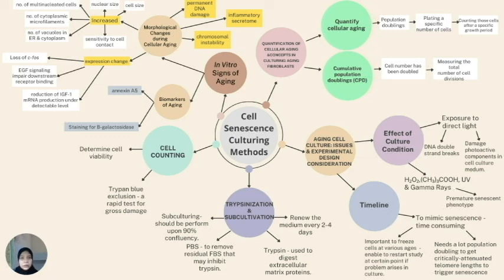It is better to study one serially cultured sample of different ages rather than using different cultured samples and examining them at different time periods. This enables the researchers to restart the study at a certain point if any problem arises in the culture, rather than re-examining the culture sample at different periods, which can take a long time and waste energy. Hence, it is important to freeze the cells in liquid nitrogen at various ages.